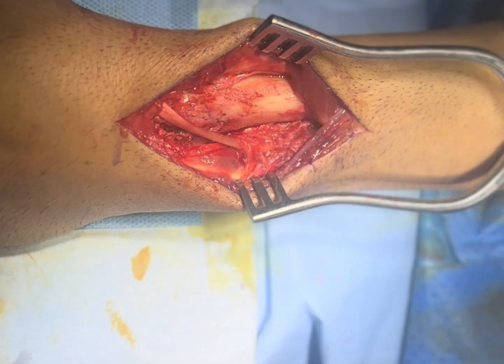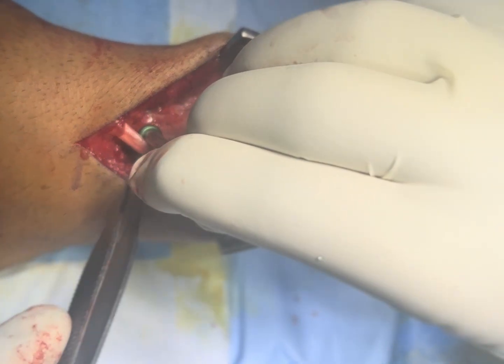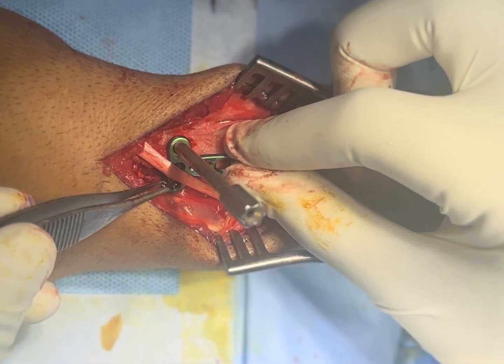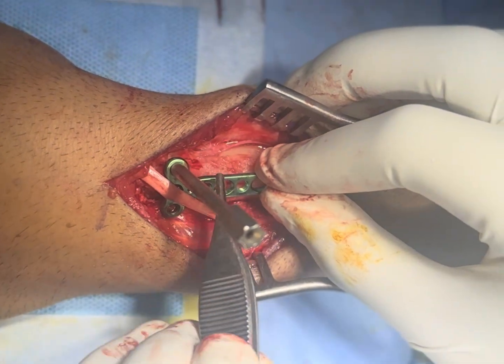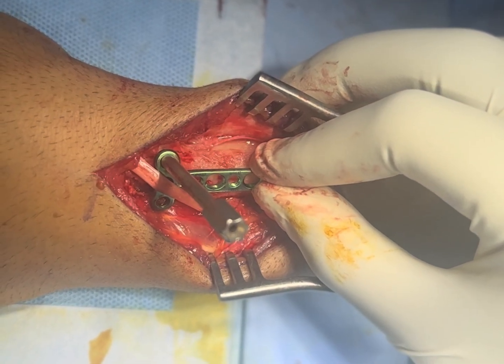We are now going to put the T-plate. In the dorsal approach, the main concern is irritation of the tendon, so we will try to put some soft tissue in between the tendon and the plate. First we are going to put the locking screws and a cortical screw to compress the plate, and then we will check on the C-arm.